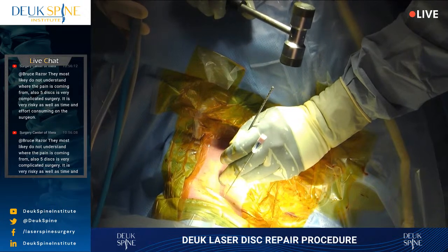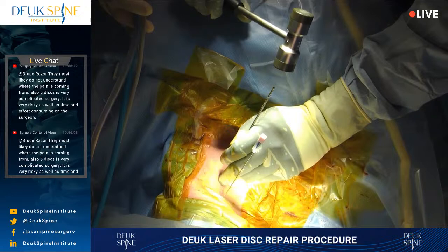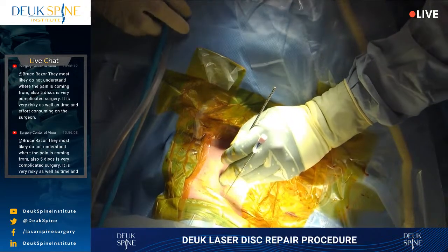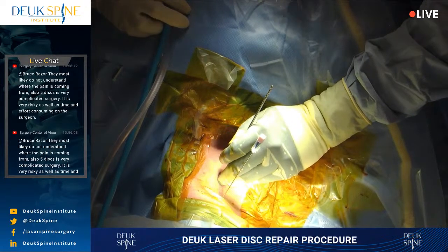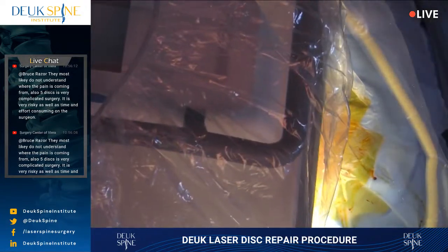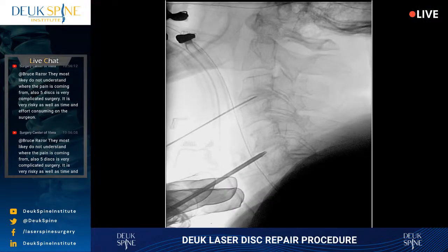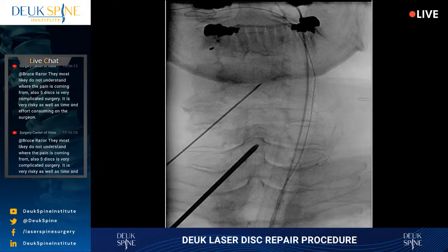Shot. Shot. Give me an AP. Just want to make sure we're making good progress and staying in the middle. Yeah, we are. Lateral.